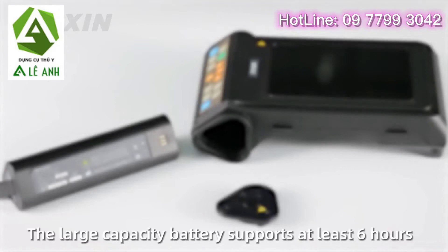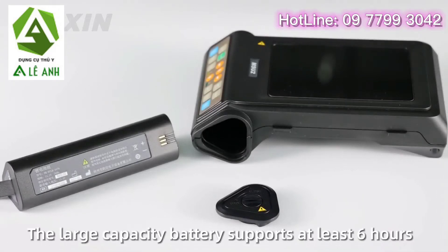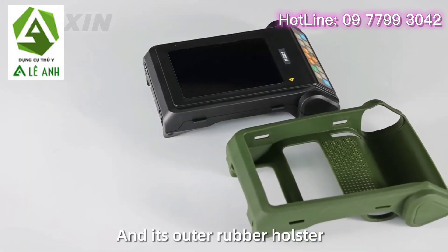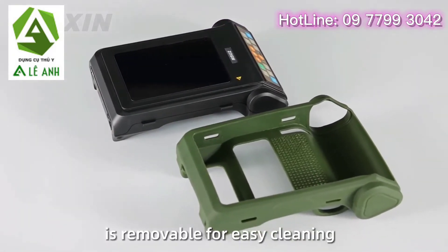The large capacity battery supports at least 6 hours of use, easy to be charged with an independent battery charger. Its outer rubber holster is removable for easy cleaning.